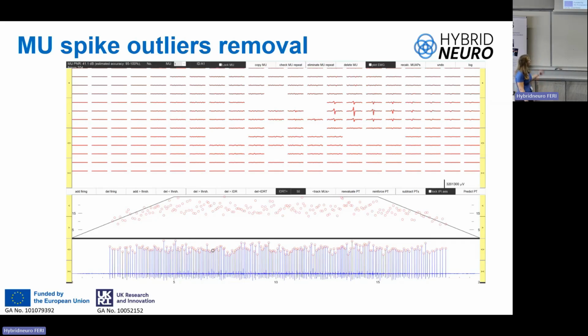And maybe here we can also observe the pattern that was shown in the middle panel. We can see that the motor unit slowly increases its instantaneous firing rate during the ramp up phase. It was nearly constant during the hold phase, and it also decreased during the ramp down phase.